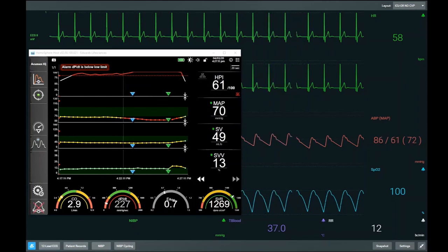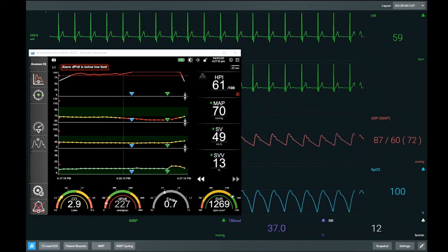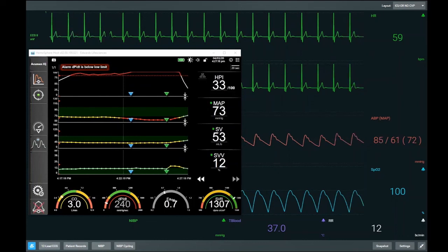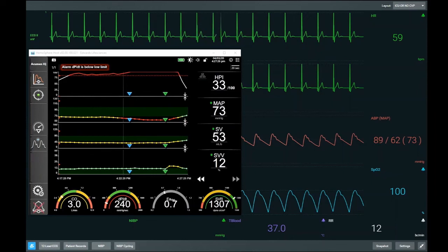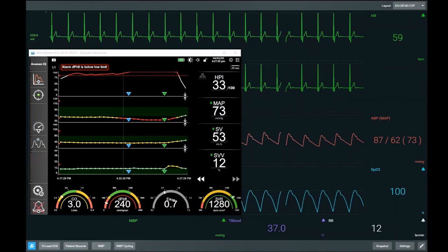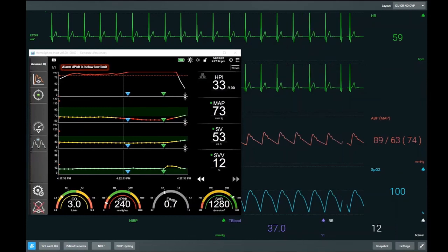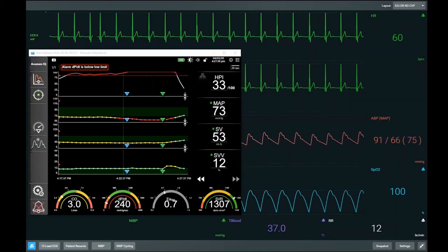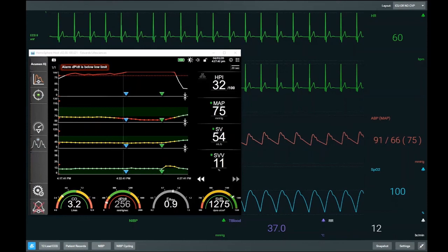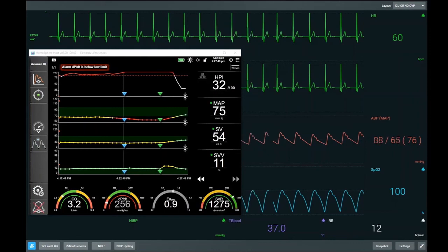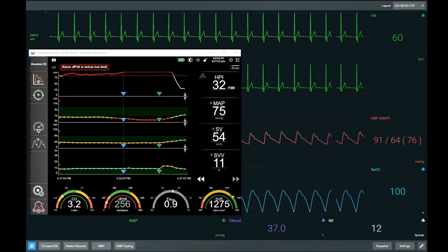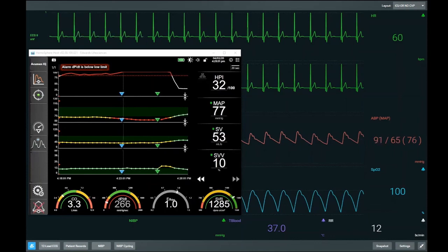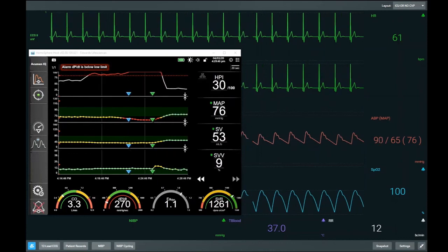By using secondary parameters such as SVV, DPDT, SVR, and EA-dyne, we can investigate the underlying physiology causing hypotension, decide what the incorrect treatment is, and decide the correct treatment to rectify the underlying physiological state. Now at the end of the simulation, we can see ephedrine has had its maximum effect. Blood pressure has increased outside the range where harm is associated, stroke volume is dramatically improved and higher than baseline, HPI has come down to a lower level implying increased cardiovascular stability, and DPDT is back to 256 — our pre-induction baseline value when the arterial line was placed before anaesthesia commenced.